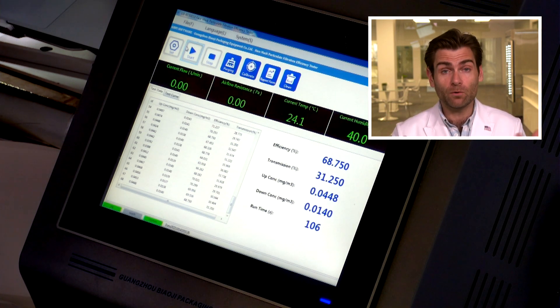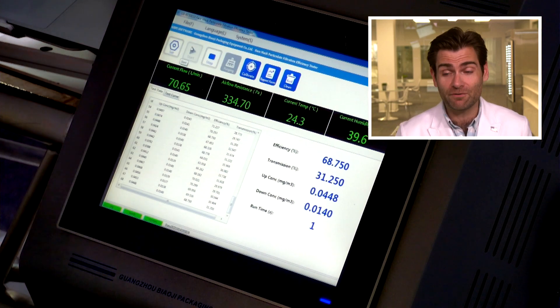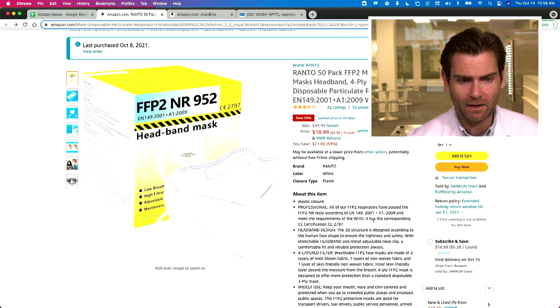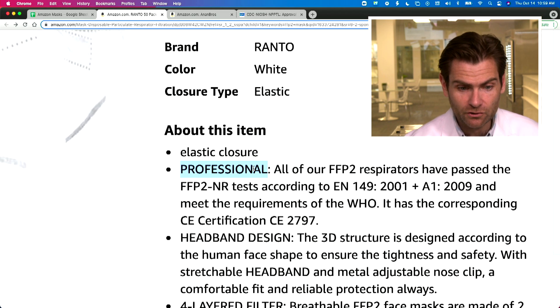This is a PFE machine — a particulate filtration efficiency machine. It's the only reason you should be showing up to listen to me talk, because I don't know what I'm talking about, but this machine does all the talking for me. Ranto 50-pack, bought on Amazon. It's professional — don't worry, professional.